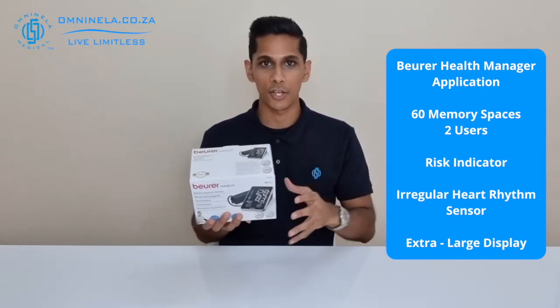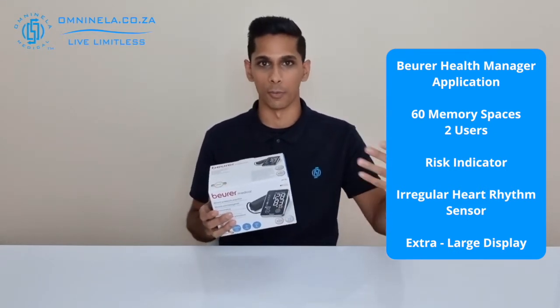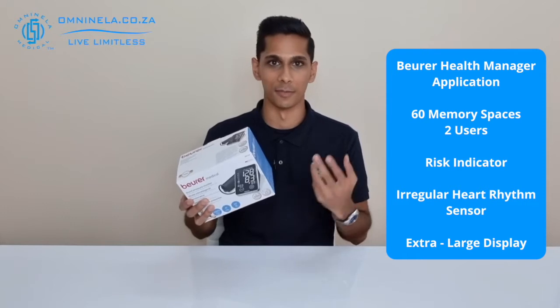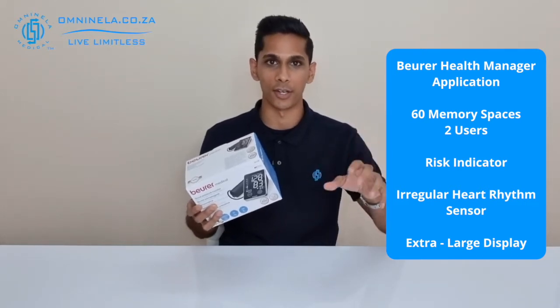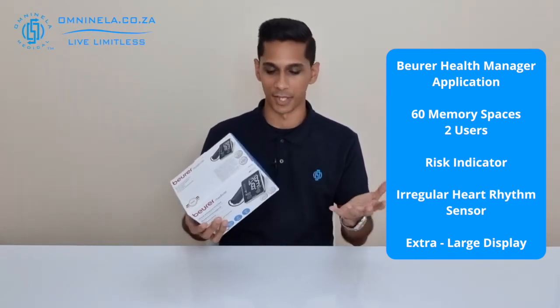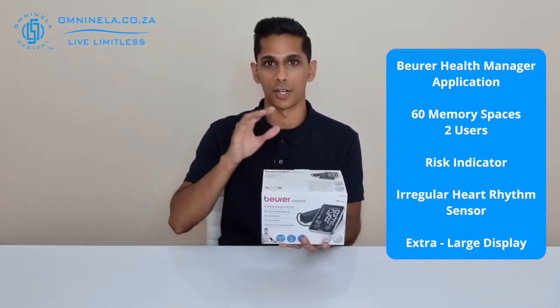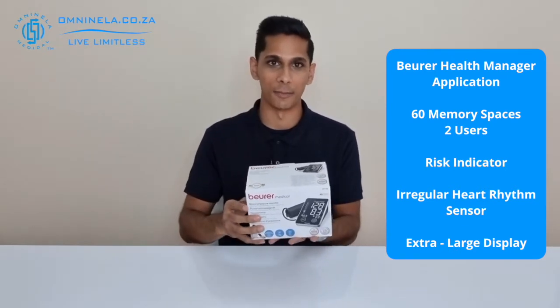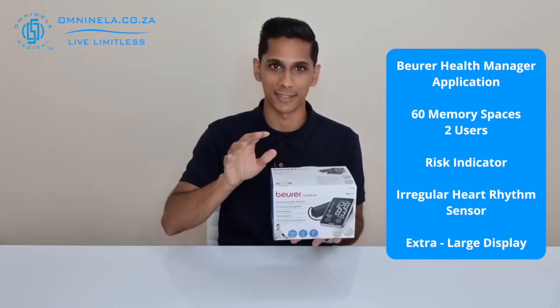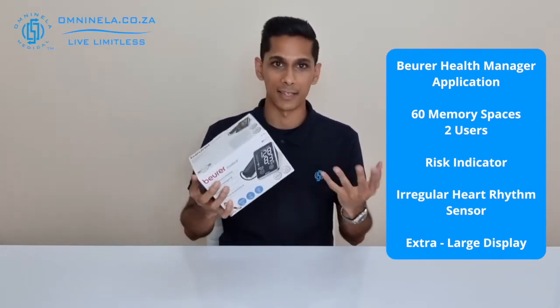Inside here you've also got your risk indicator, so on the screen of the device you're going to get a risk indicator which shows you the severity of your blood pressure at that exact moment of testing. It's also got an irregular heart rhythm sensor, so if there is something going on irregularly with your heartbeat, this will be able to tell you, and you'd be able to inform your doctor from there. It's also got a nice extra large display with a black backing and bright white text, which is ideal if you have difficulty reading text on a screen.